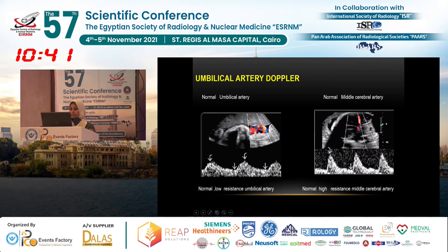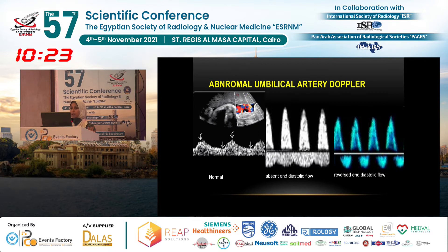So again, this is normal. To understand the concept of high diastolic flow, this is the same patient — the middle cerebral artery waveform shows low diastolic flow, which is normal. What is the abnormality in umbilical artery Doppler? Instead of having high diastolic flow, the diastolic wave can be either absent or even reversed. If we find one of these signs, we can suspect fetal compromise.